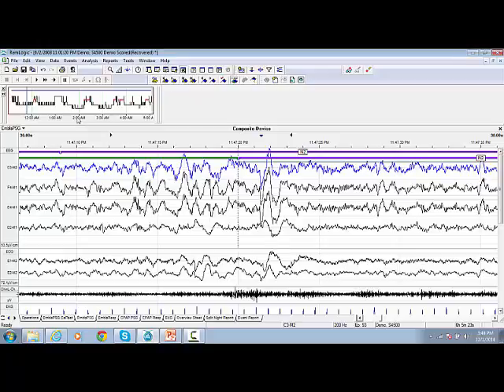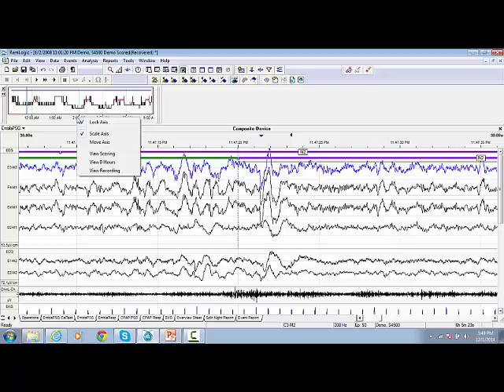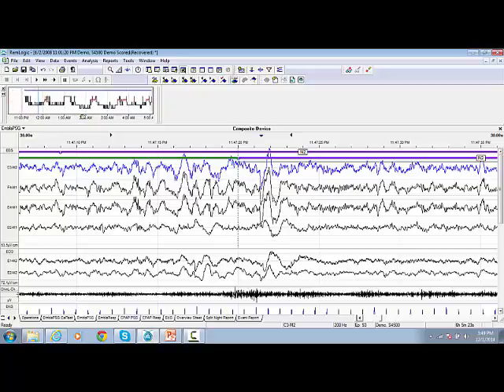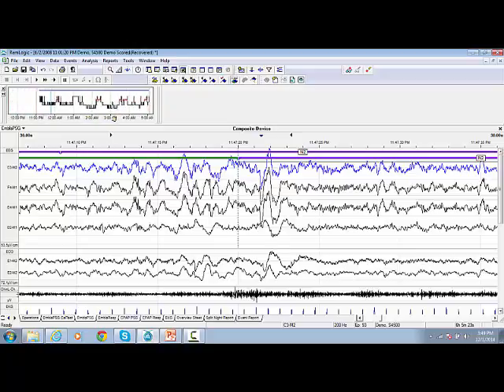If you want to scale the hypnogram view, then right-click on the x-axis and unlock the axis. Then, when you move to the x-axis, the pointer will be changed into a hand sign, where you can scale it and squeeze it.